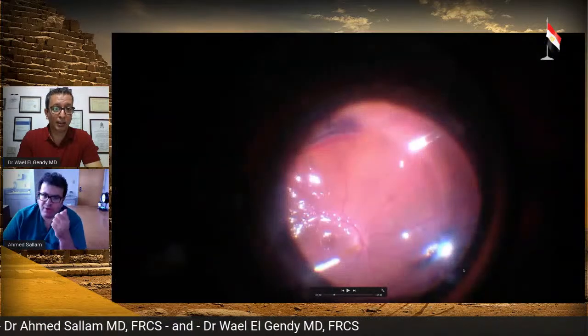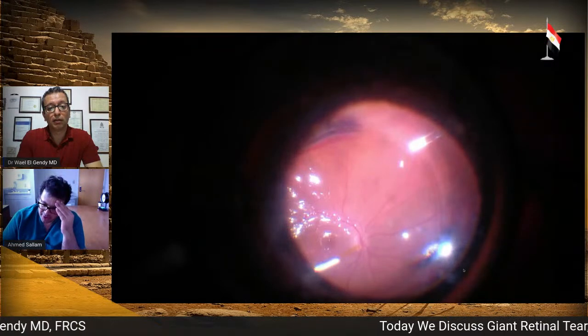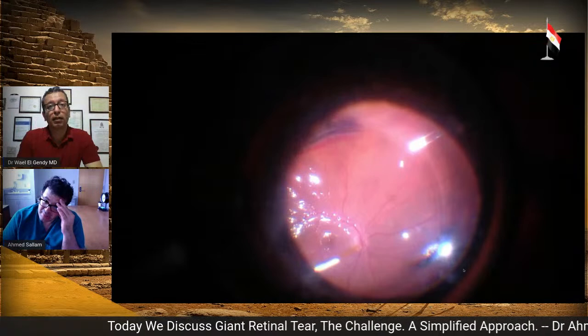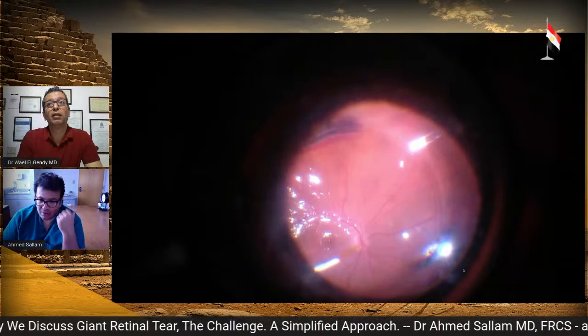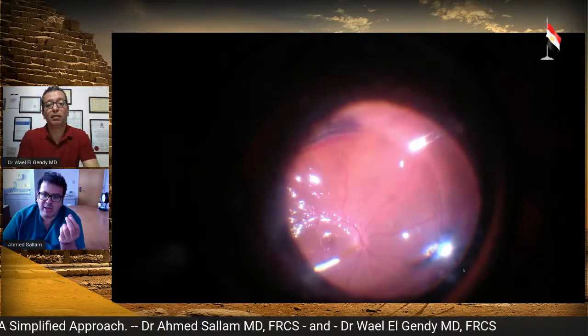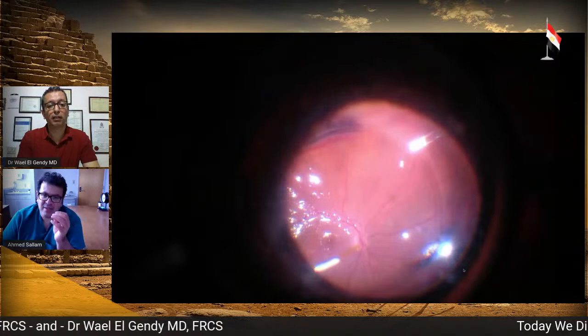So inject from far. I would shoot for the optic nerve, although some people argue that shooting an optic nerve might not be a good idea. But most people I know would shoot aiming towards the optic nerve and not the retina. Shoot from a distance. Do it slowly. Even if you get fish eggs initially, fine, but get it to coalesce.